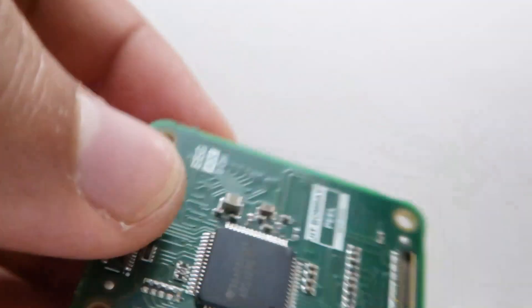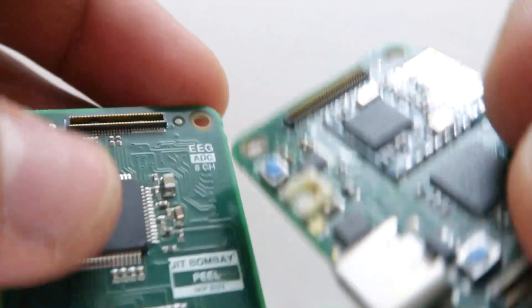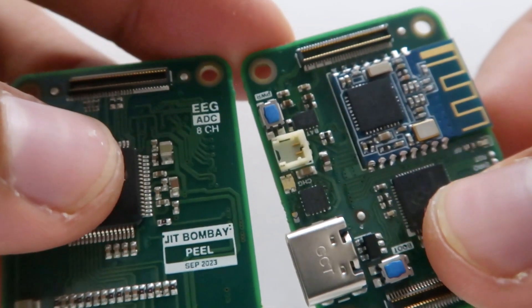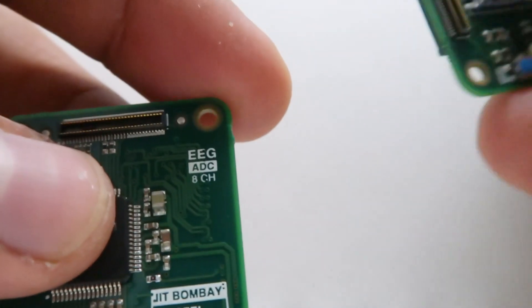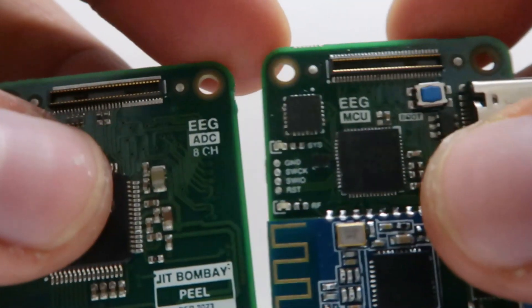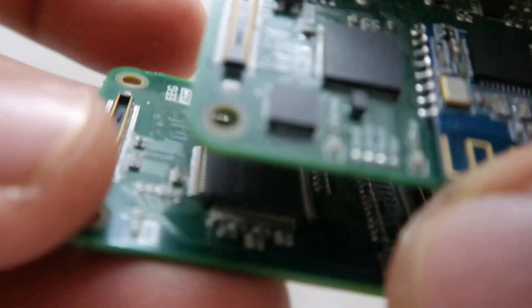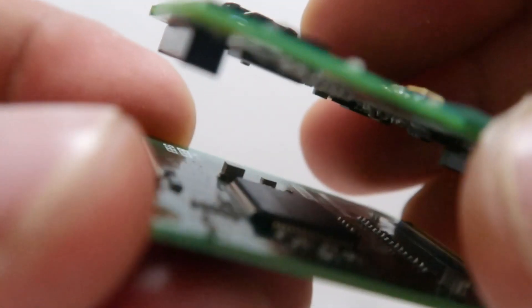To stack these boards, we have to line up the silkscreen in the proper direction — this is the wrong direction, and now this is the proper direction of stacking. Once we have determined the direction, we need to line up the DF40 connectors.